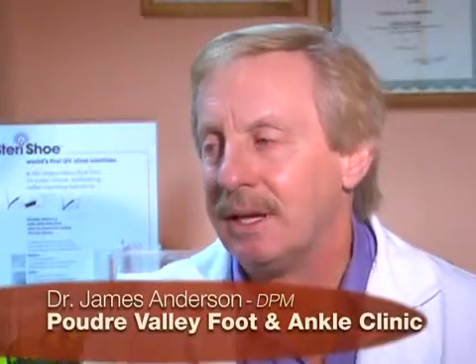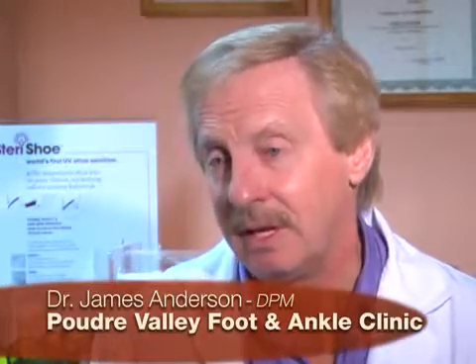It's important for your listeners, viewers, to know that this is not a very fast treatment. They're not going to have clear nails instantly. It takes a while. We usually have people come back at 4 months, and a lot of times, even at 4 months, you don't see a lot of improvement. But at 9 and at 12 months is when you see the greatest amount of improvement.